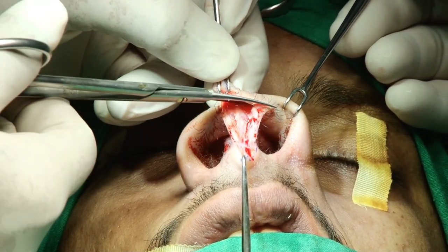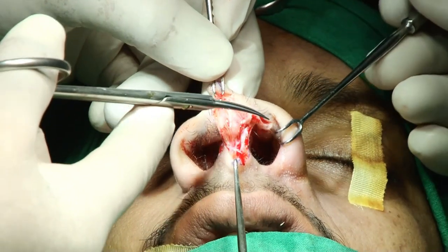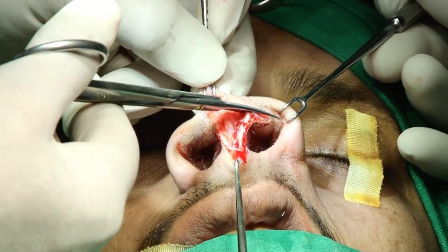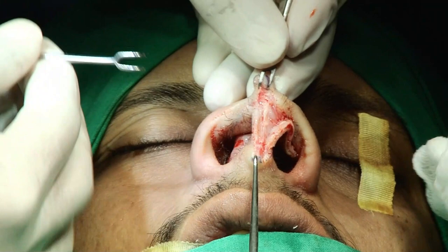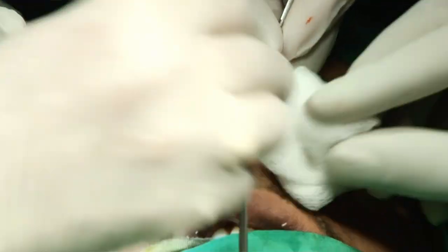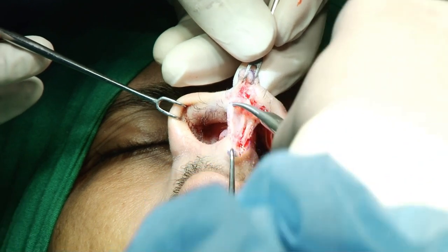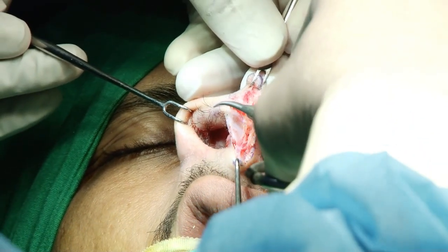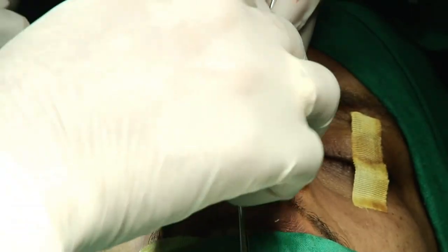Then you can identify where the scissors are working, and you never go towards the lateral side, just go in the anterior inferior direction. Now on the other side, along the margin of the medial crus and the lateral crus. How lateral do you go? I think at least 2/3 of your lateral crus should be exposed, because good exposure is mandatory for good surgery.